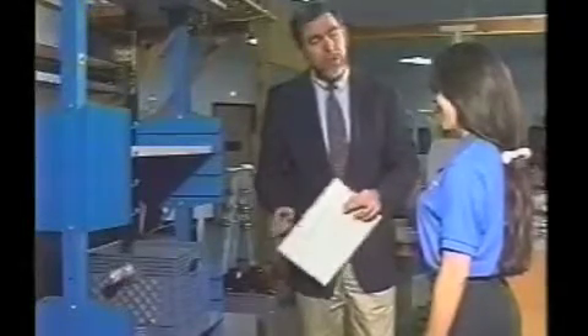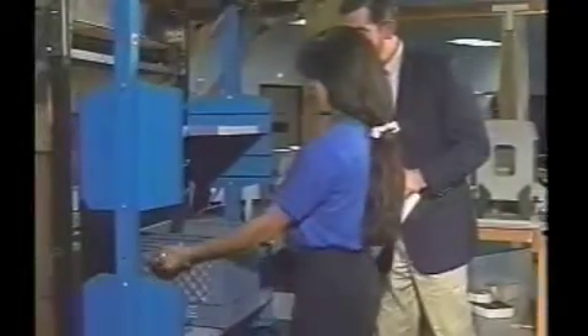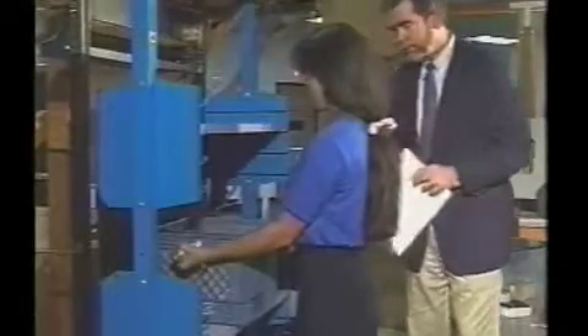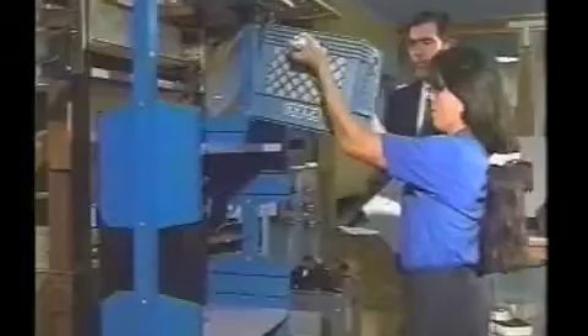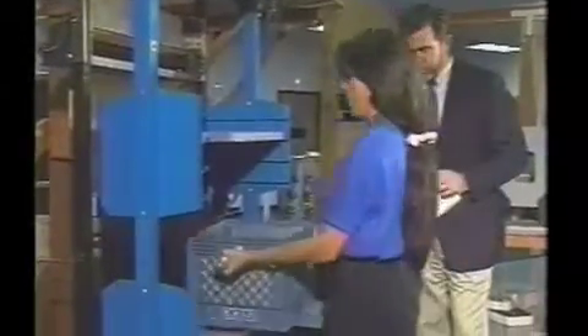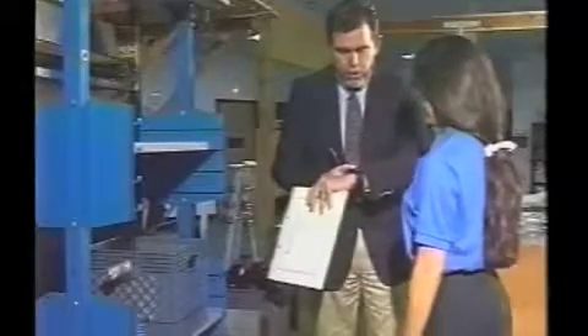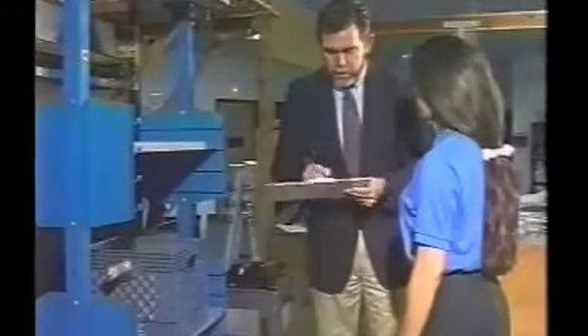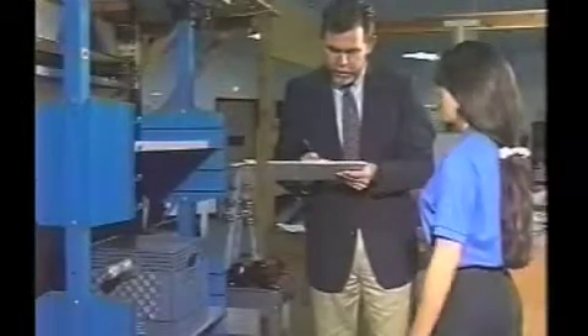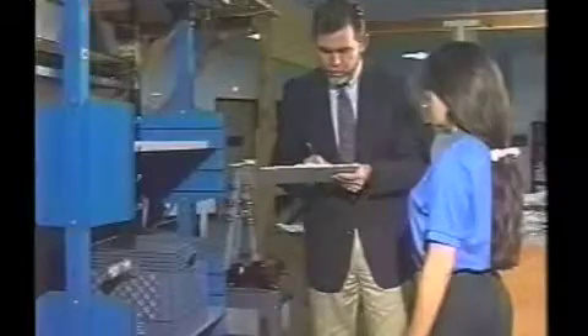Are you ready to go? Any questions at all? Let's go ahead and give it a try. Go ahead and grab the handles — you can grab either underhand or overhand. Pick it up from that shelf and move it on up to the shelf, and then take it back down again. Would you rate that for me, please? [Margaret: One.] I'm going to get your heart rate here. Is that a weight you could lift on a safe and dependable basis 8 to 12 times a day? [Margaret: Yes.] And can you handle more weight? [Margaret: Yes.]